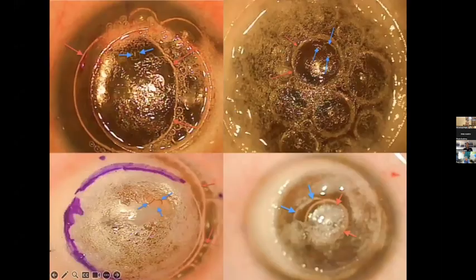So these are examples of pictures showing the microbubbles, but this is the small bubbles which will guide you, and these are the bubbles in the anterior chamber. So to make visualization easier and to make identification of the microbubble easier, either you may have to evacuate the bubbles in the anterior chamber, or you may replace it by a big bubble which will enhance the visualization.